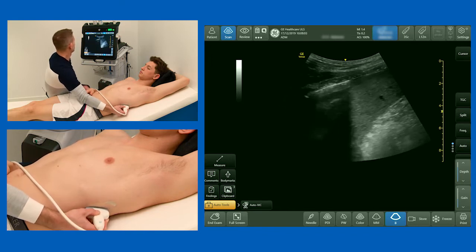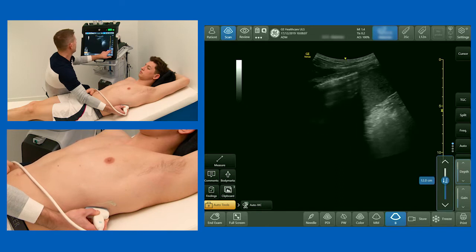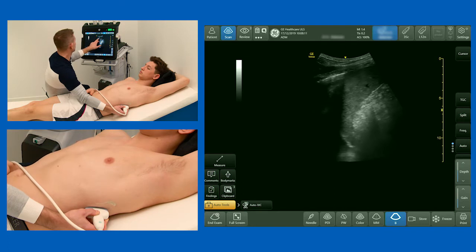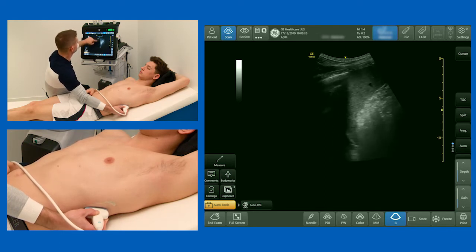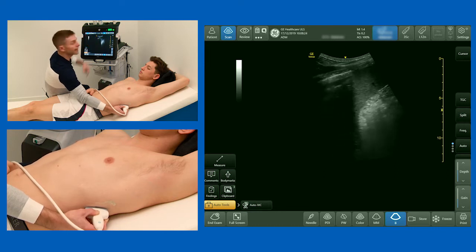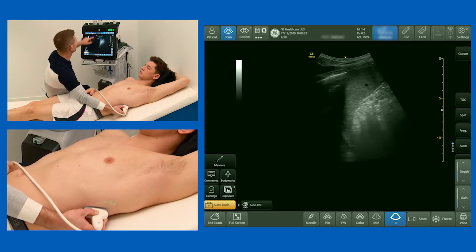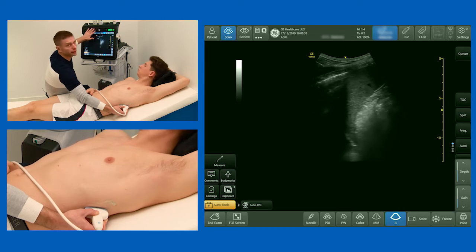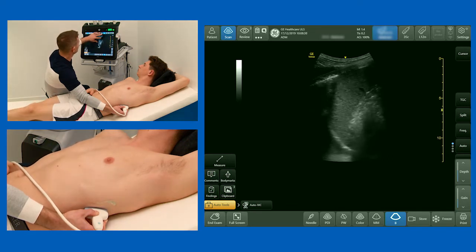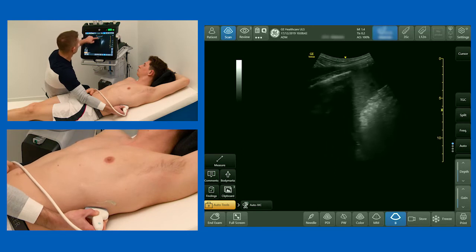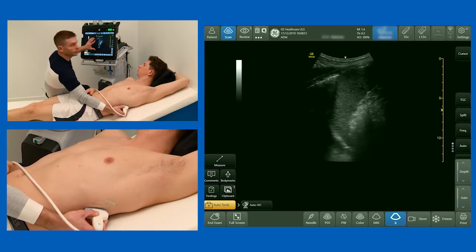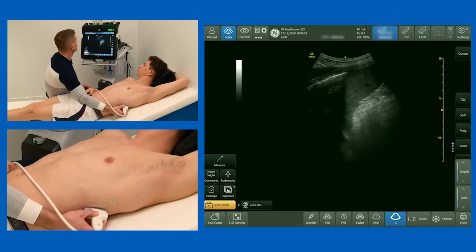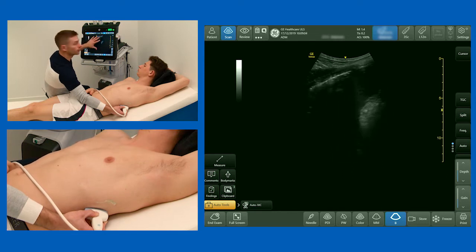Moving the probe around to get the best image, I drop my depth. What I'm seeing here is the spleen, the pleural line, and the back of the diaphragm at the bottom of the image. The reason some of the spleen appears cut off and the full diaphragm isn't visible is because there's air in the costophrenic angle — air reflects all the sound waves back to the probe. The spleen provides an echo window, but the lung blocks the sound waves. This is what a normal lung base should look like — you won't be able to see all of the diaphragm and all of the spleen or liver.